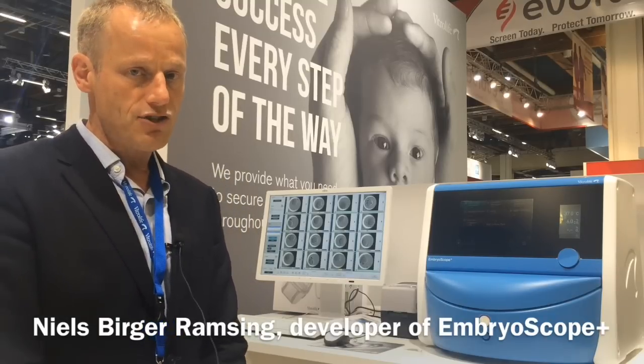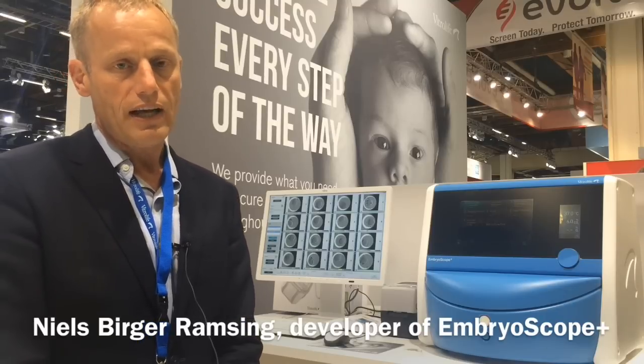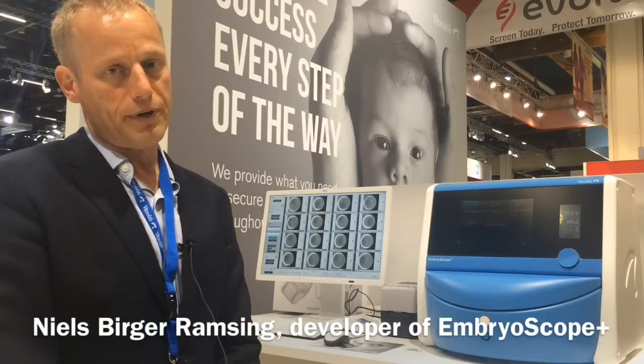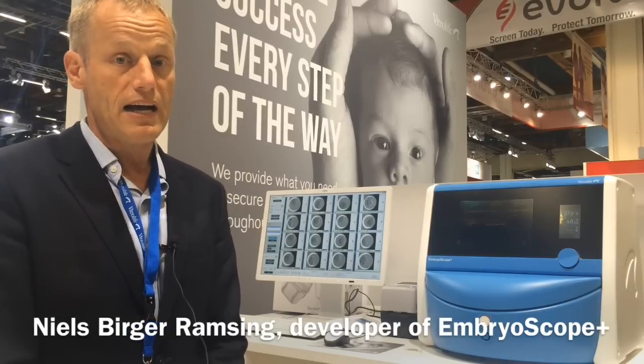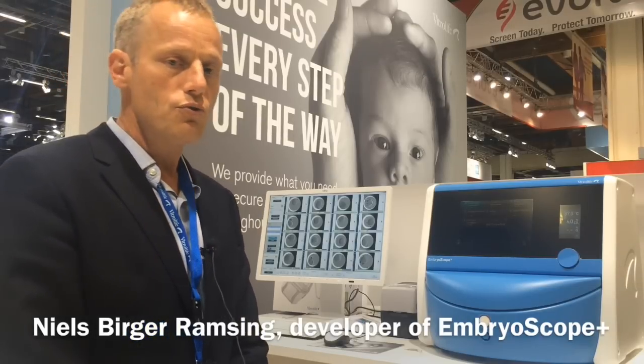It takes 15 patients, and each culture dish can have 16 embryos, so there's room for 240 embryos in one single instrument. Yet the instrument itself is not larger than the original EmbryoScope — in fact, it's a little bit smaller. This also helps with gas usage.